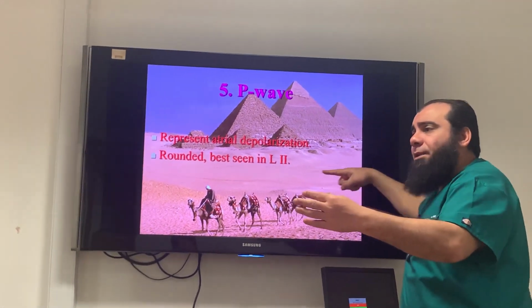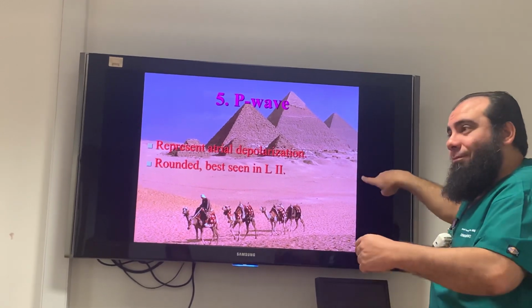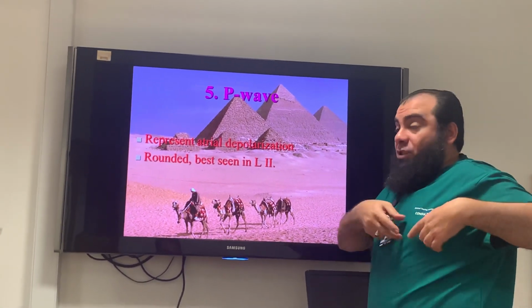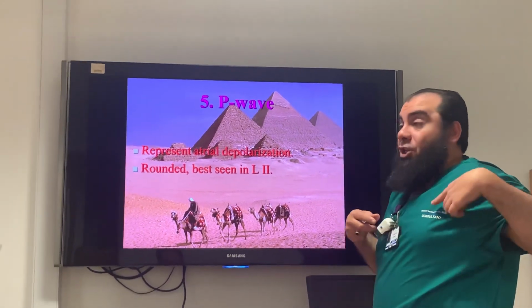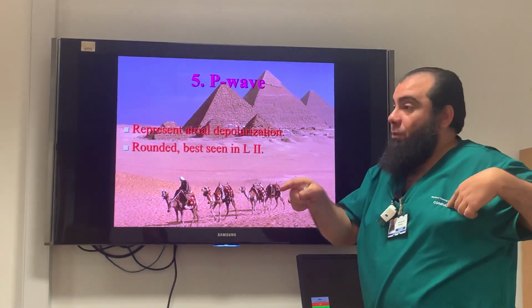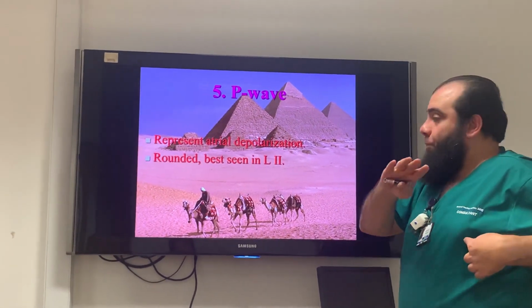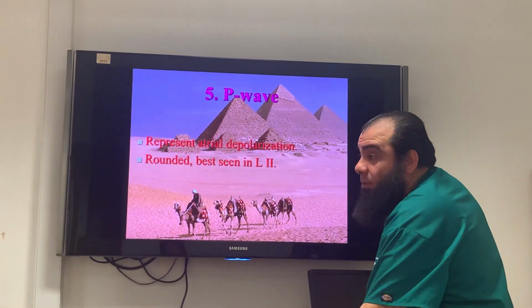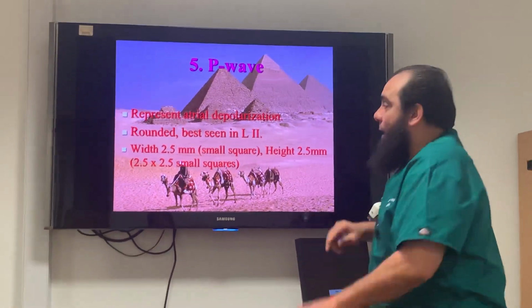It can see the heart directly, because the apex is here. Lead 1 P wave is always positive as well, and this criterion I'm going to discuss later. But lead 2 is the best lead to see the activities, rate, rhythm, and structure of the P waves.